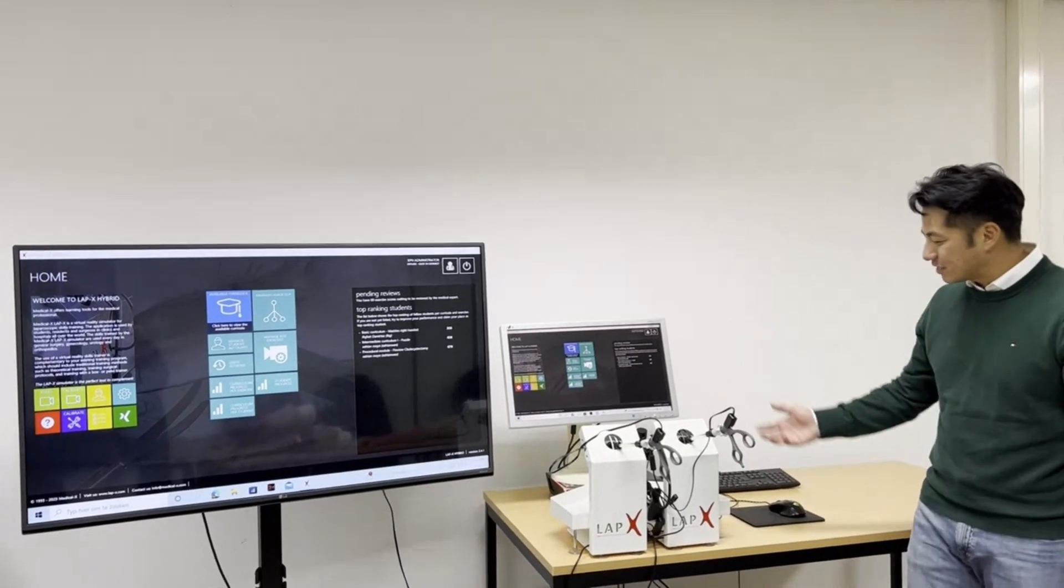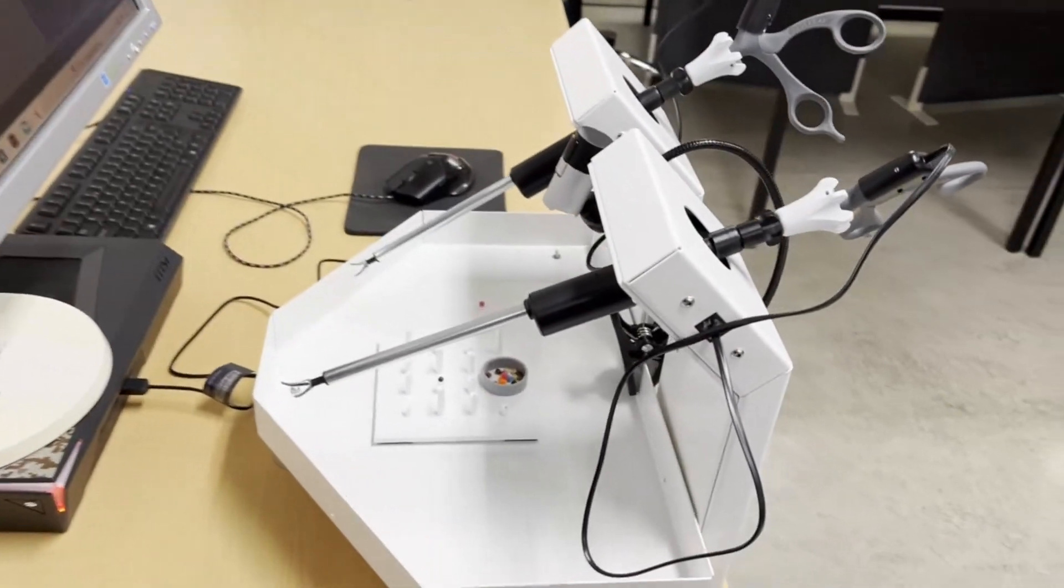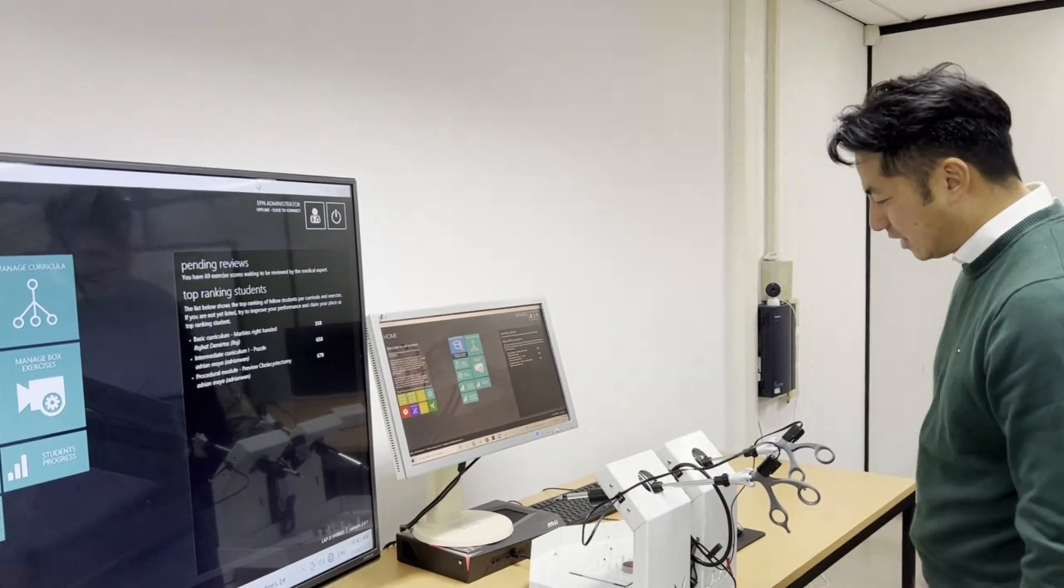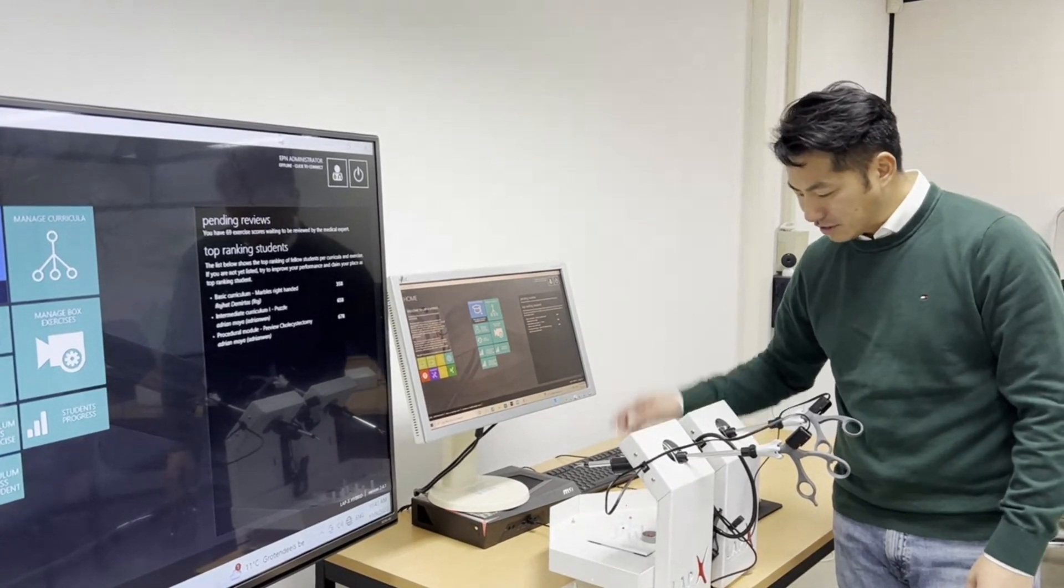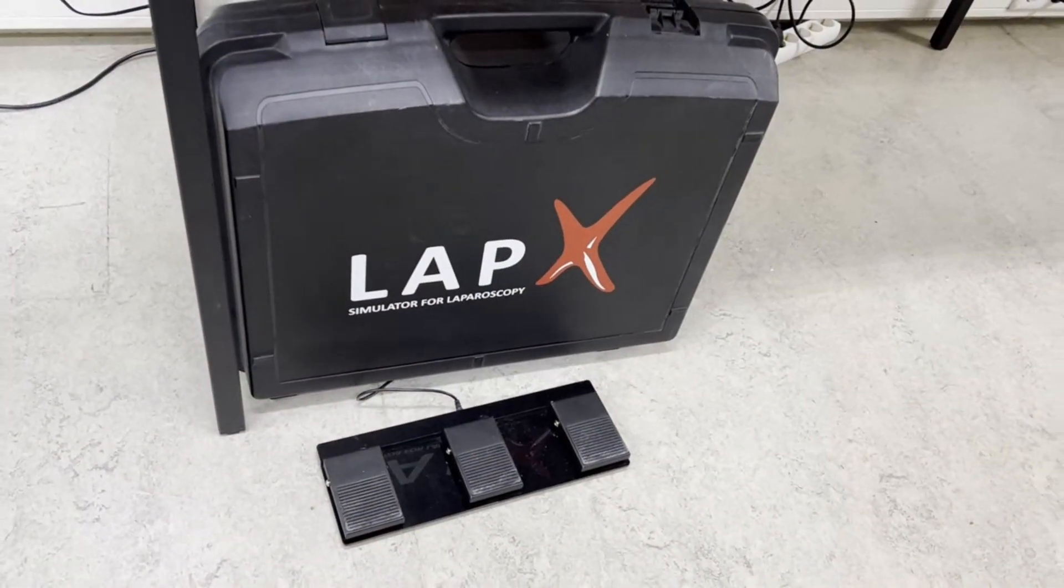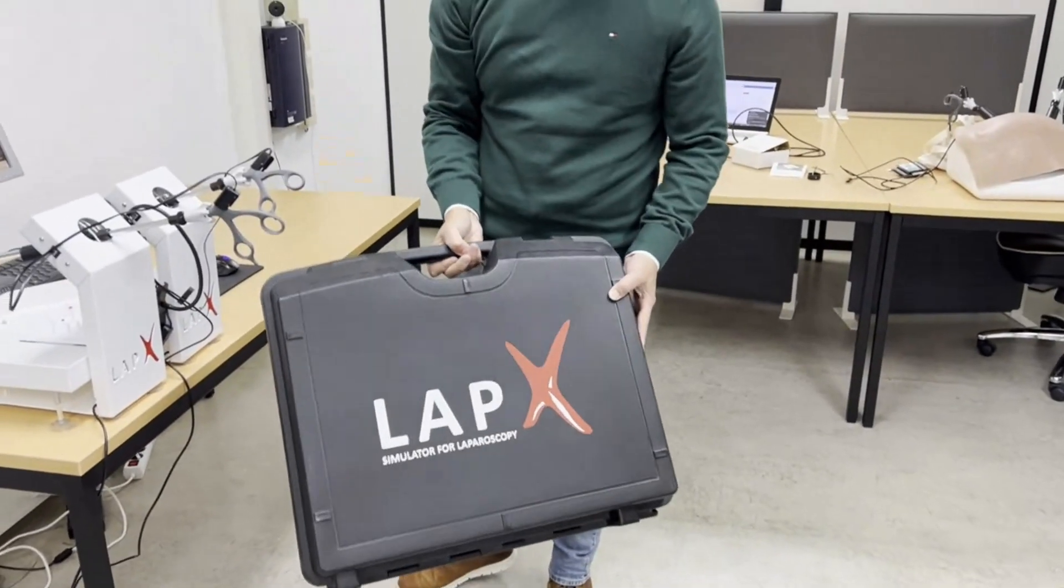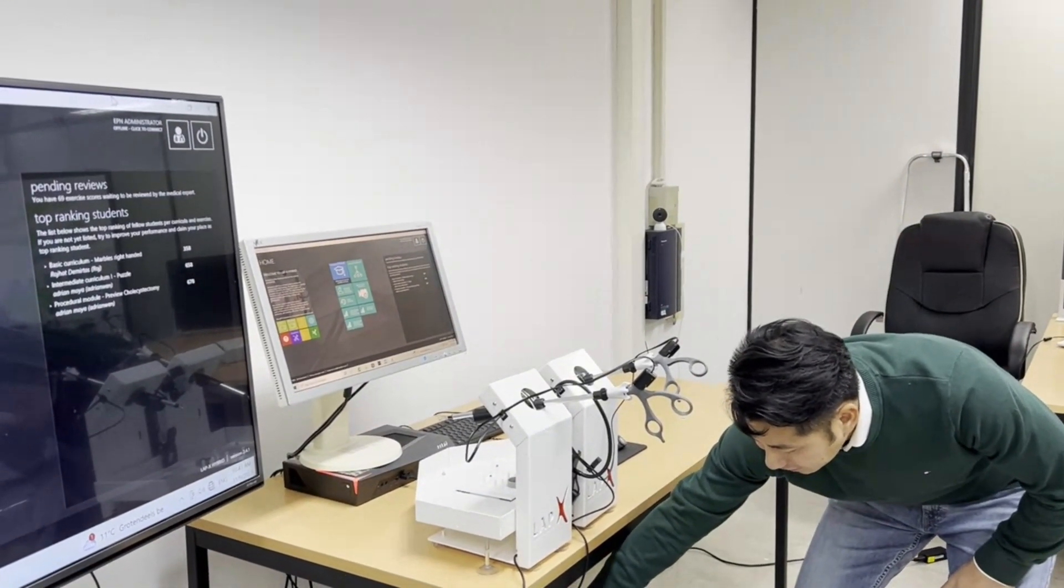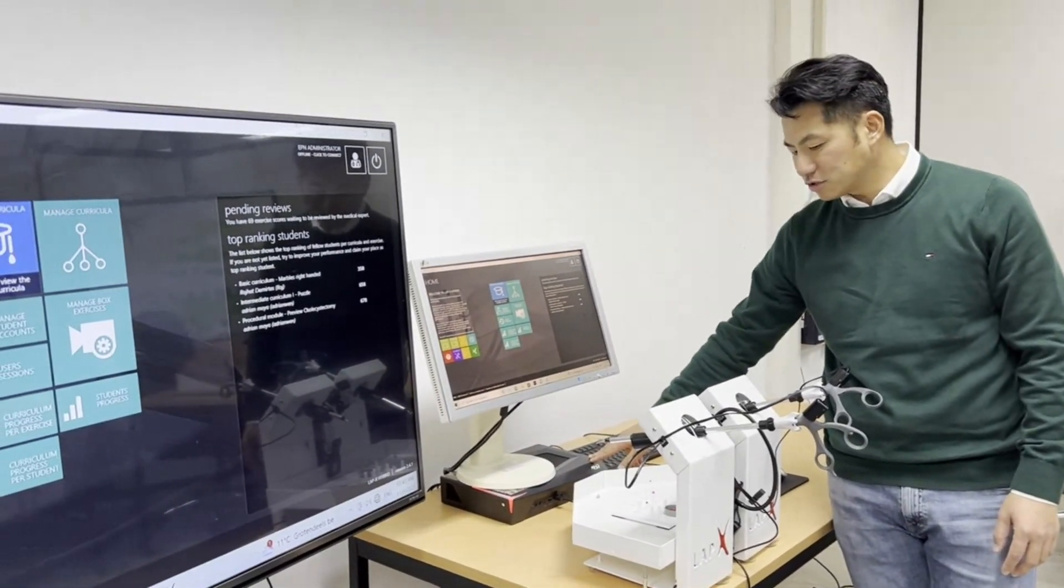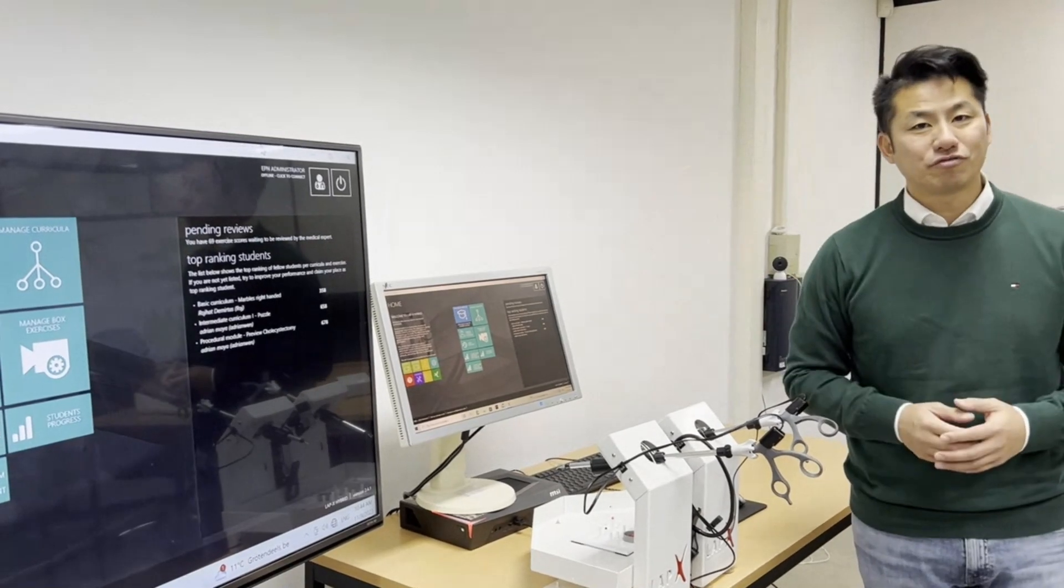So I've set up the LAP X, it's the LAP X hybrid configuration and the LAP X consists of a few components. We have here two controllers, one for the left hand and one for the right hand. This is the box training table with the camera to show the exercise on the screen and it also comes with foot pedals. The foot pedals have different functions for different exercises and the LAP X also comes in a suitcase where you can fit everything inside. The LAP X is connected to the computer with USB cables so you don't need external power source and finally the LAP X comes with the LAP X software of course.